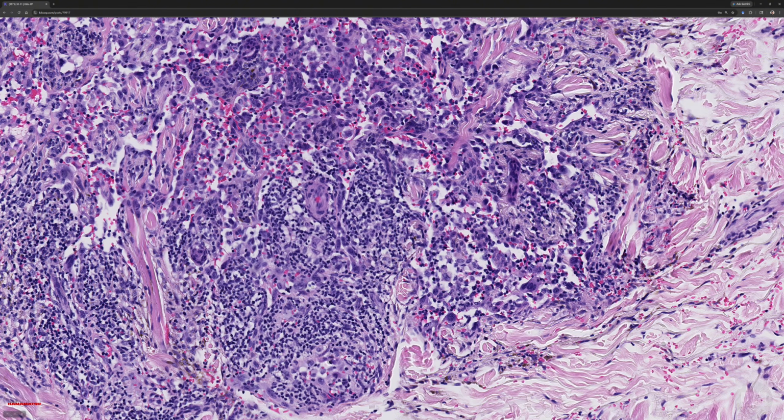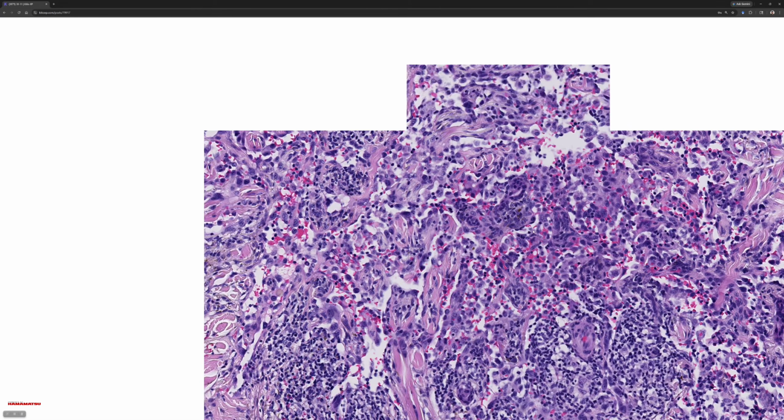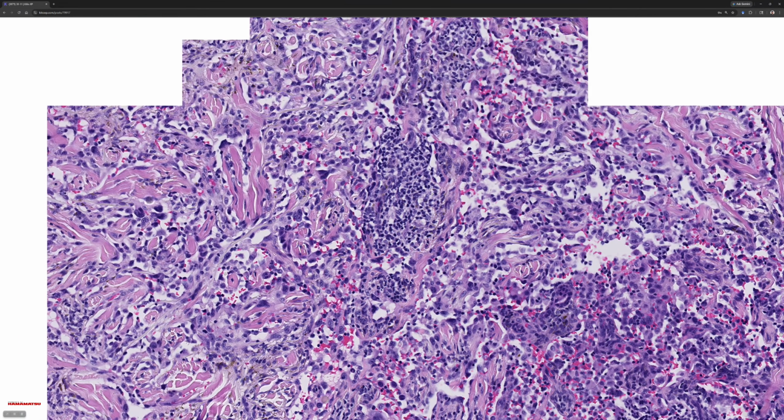The main exception being by the great vessels, like the pulmonary artery, the inferior vena cava, or the aorta. You can have something called intimal sarcoma that can sometimes have angiosarcomatous differentiation. But aside from that, or cases of Dacron vascular graft-associated angiosarc, the vast majority of angiosarcs start in the dermis like this, and then infiltrate everywhere else, but they don't usually start in the lumen of a vessel, okay? So that's important, kind of counterintuitive.